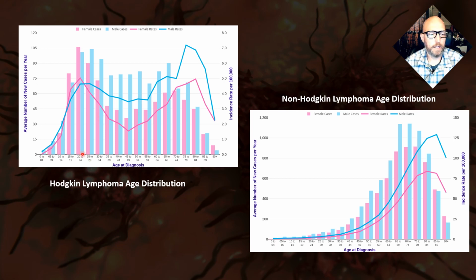And so you're not really going to see Hodgkin lymphoma as a sign in oral radiology. On the other hand, non-Hodgkin lymphoma is 2 to 8 times more common, and it does metastasize into the bone. It will metastasize into the jaws, and it can metastasize around the teeth, as we just showed on the previous slides. And non-Hodgkin lymphoma, look at the age distribution, is going to be really rare, even in the teens, but especially under 10. And so with lymphoma, I'm typically thinking of an older age patient population, and that tends to be what you see.